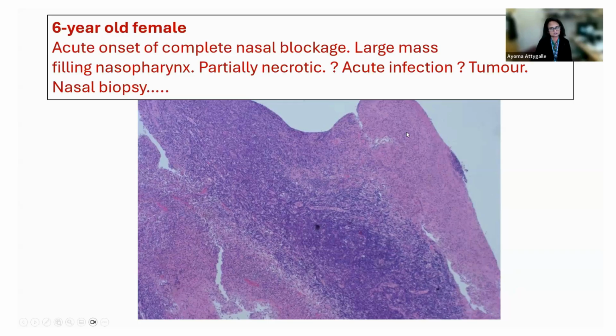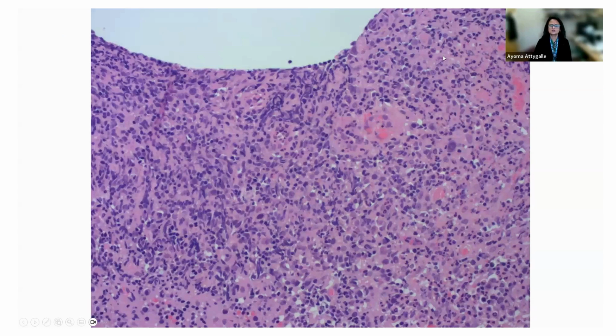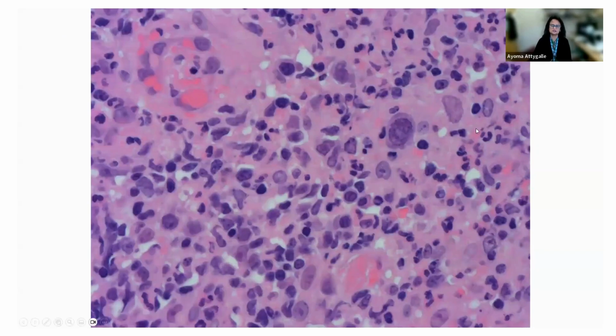So you're seeing a lot of ulcer slough here. And just beneath this ulcer slough, if you look at this area, this is what it looks like. So you can see the slough here, but here you can see that Reed-Sternberg cell that I showed you. We'll see it in higher power in a minute. And you're seeing again this spectrum of cell size. They're a similar population, but of varying size. They are not different cell types. And you can see here, this is this Reed-Sternberg cell and other large cells. This one has a very large nucleolus.